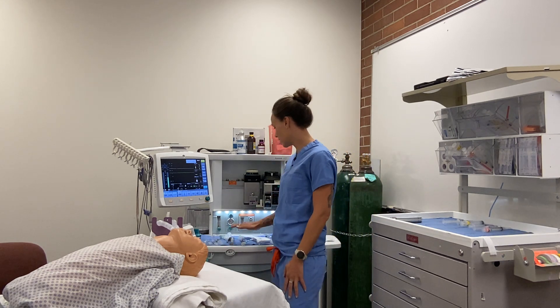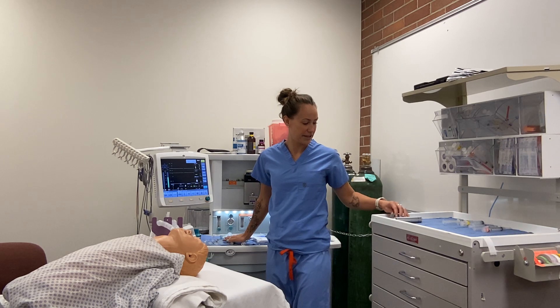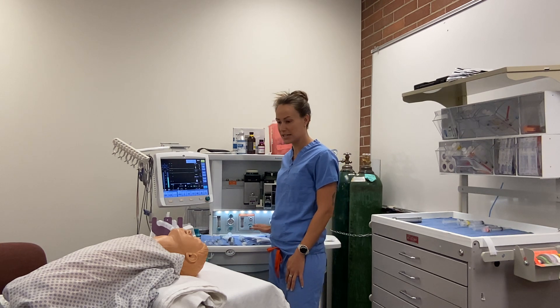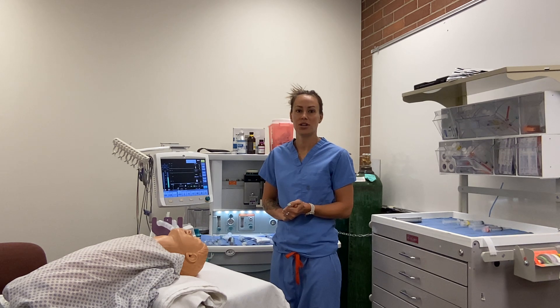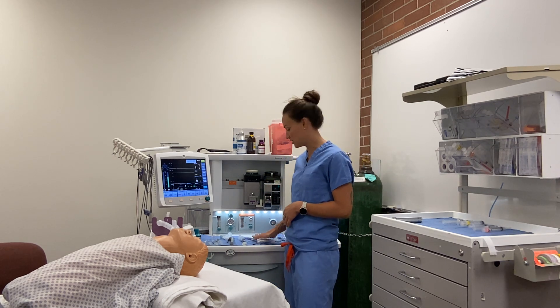I have all my airway supplies — pediatric oral airways, a Mac and a Miller blade. I'm going to have a Mac size 2, a Miller size 1. I'll have the appropriate ET tube size for this patient, who is going to be 5 years old. We take age plus 16 divided by 4, which gives us a size 5 ET tube, and then I have tubes in each direction just in case.